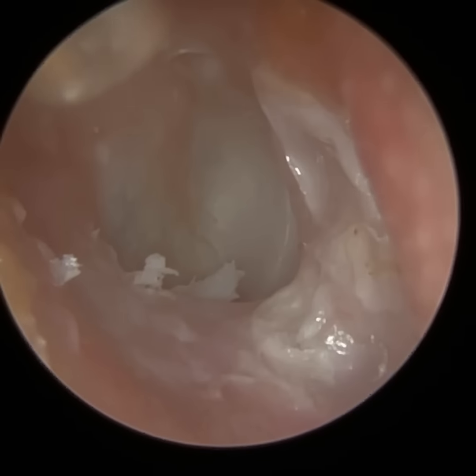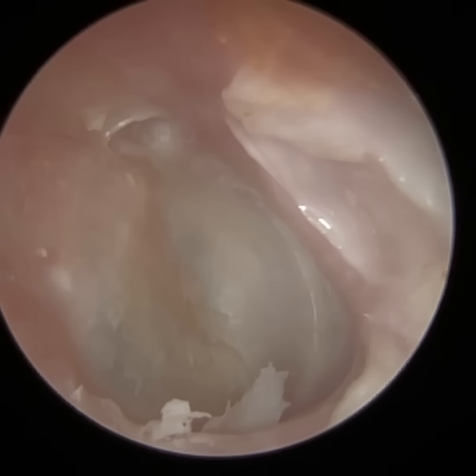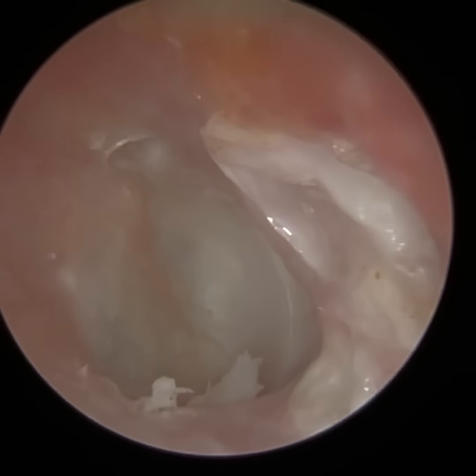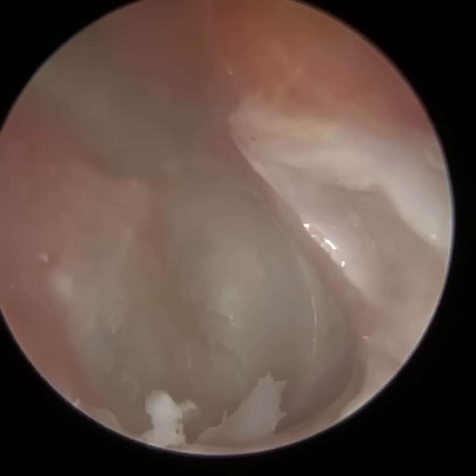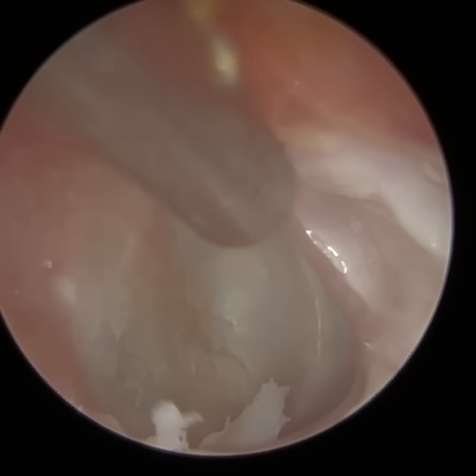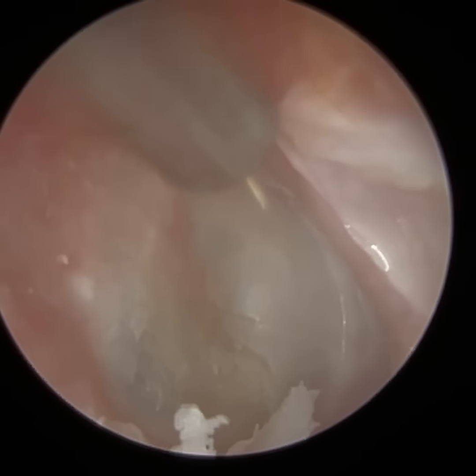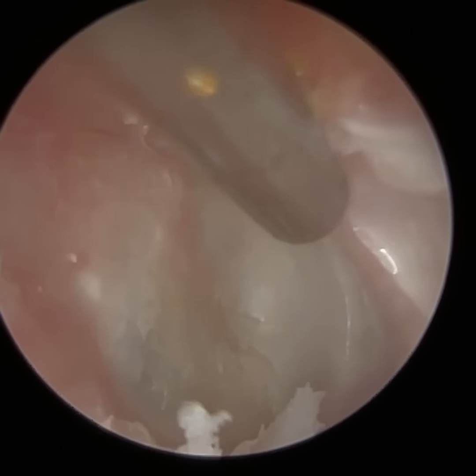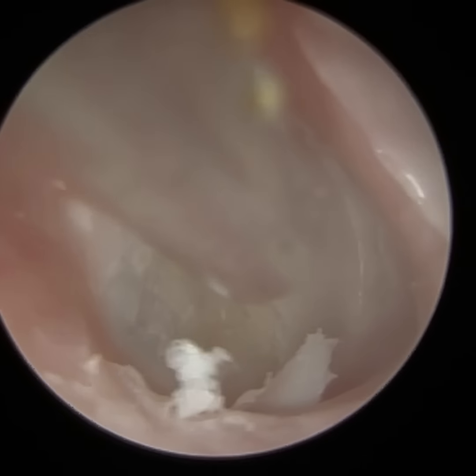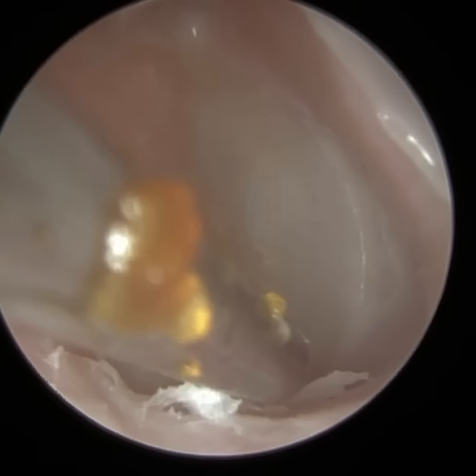So we're literally on the bony part of the ear canal, making contact with the bone actually, because we're trying to lift this away, and it just wasn't coming away. You don't want to continue in that case, because it can be uncomfortable for the patient, as we're making direct contact with the bone. There's no ulceration here, there's no discharge, so I'm not concerned by other pathologies such as canal cholesteatoma being one, and this patient's got, as I said, a history of keratosis obturans, so we know that's what they've got.